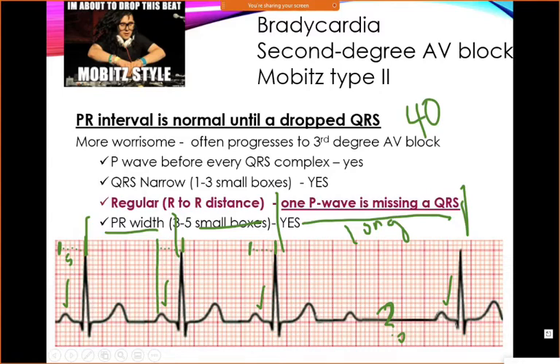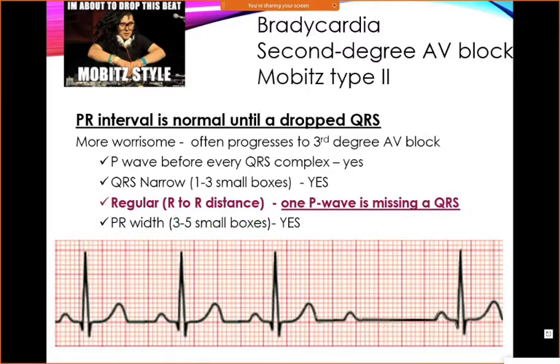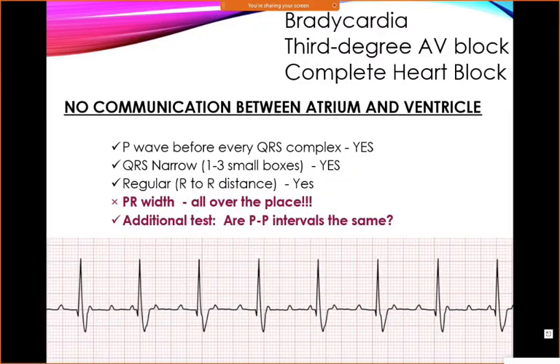The difference is that this one doesn't get longer and longer and longer before you have your messed up beat. You are exactly the same before you have your messed up beat. So this one is just dropping out of nowhere, and that one is a more concerning block than something that is either long consistently or longer and longer and longer than you drop. The third degree is really, really hard. This one doesn't really match our criteria.